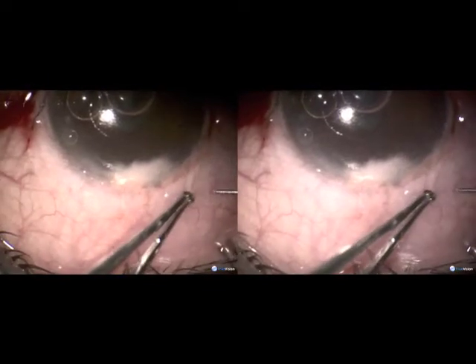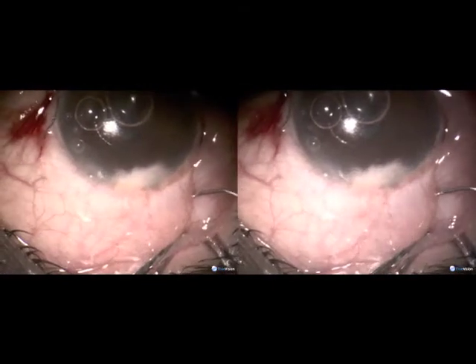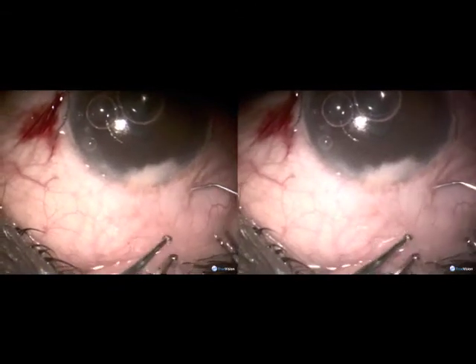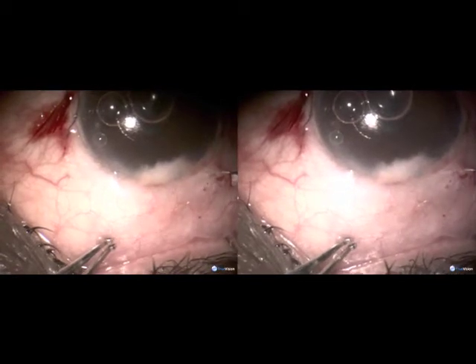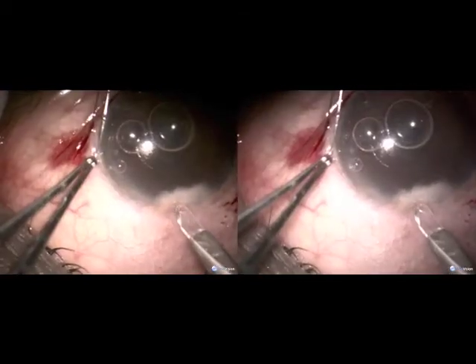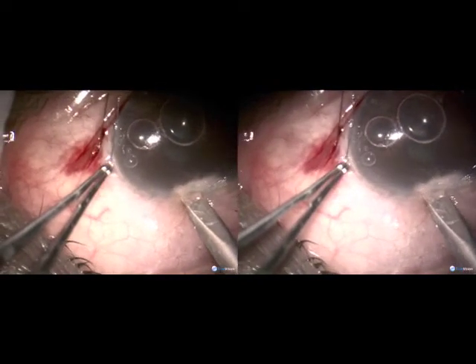Then I inject crosslinked sodium hyaluronate, which is Healaflow, on top of the external opening of the microtrack, in front of the microtrack.